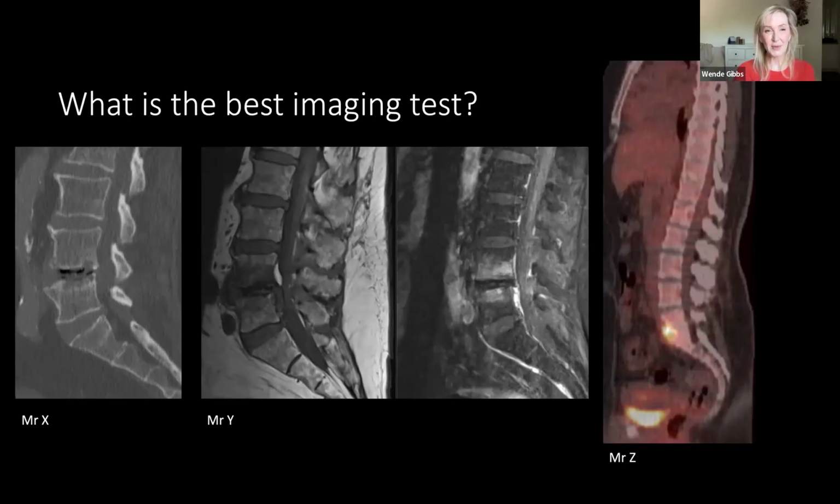The other reason I'm showing that particular picture is as another teaching point. I was taught, and I think everybody in radiology is taught, that you can't have infection if there's a vacuum disc. I know now that's not true, because I've had multiple cases where we've actually gotten infection from discs that look like this. Anytime there's still some disc in there, it can be infected, and of course, the bone can be infected as well. So don't let the vacuum, the air in there, dissuade you.